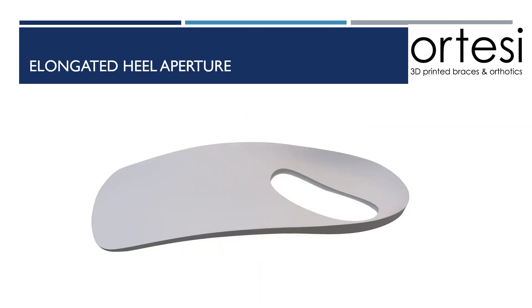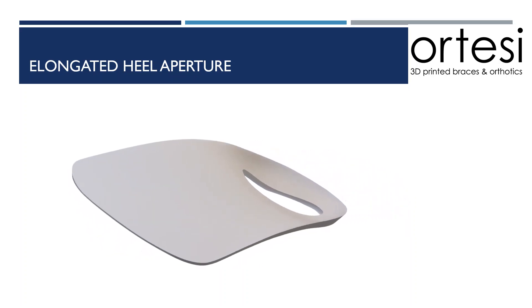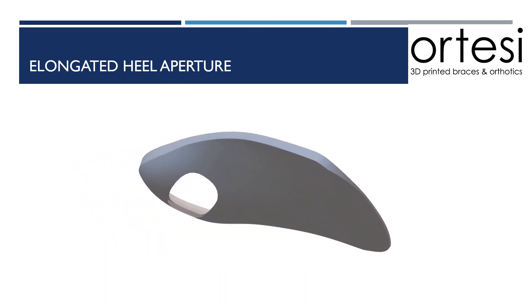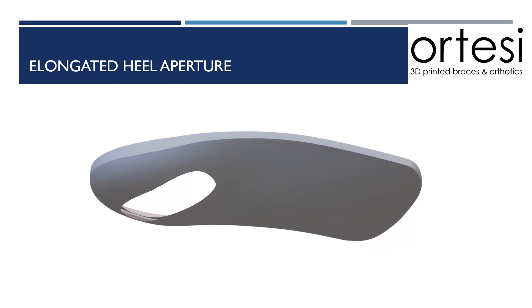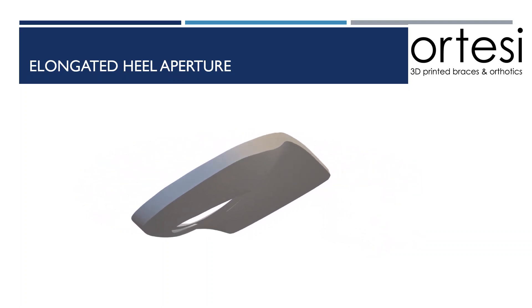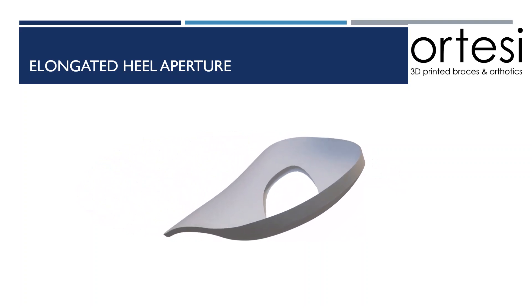An elongated heel aperture is not one of our more common modifications; however, some podiatrists request it. The modification originates in the same location as a traditional heel aperture, but it extends more anterior-medially into the shell. The aim of this modification is to reduce pressure and to accommodate the proximal band of the plantar fascia.